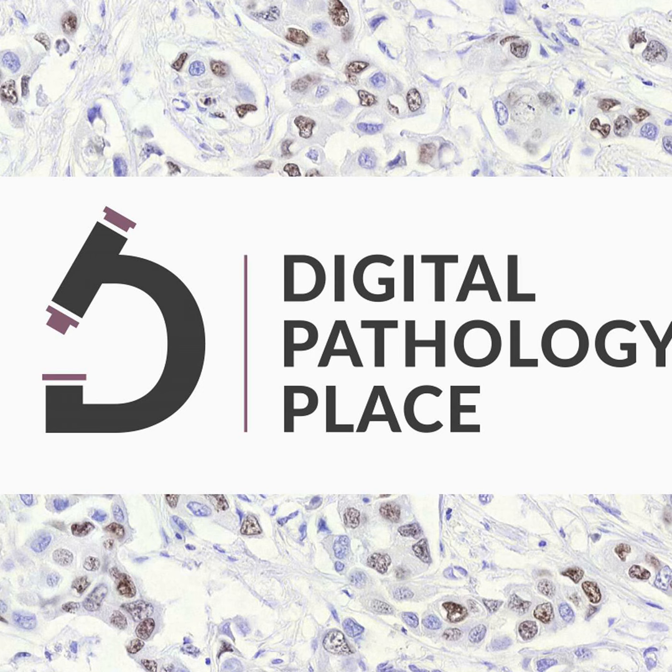So I think unless you get into something like virtual microscopy where you're dynamically judging how much information you have to take in different areas, the way these scanners work right now is that they make one digital image, and it can be zoomed up and down. And then, of course, depending on the lab use case, you need a certain bandwidth to manage that data. There's a so-called hot, warm, cold storage that might be useful for initial diagnosis versus archiving versus secondary consultations. I'm just saying those are the variables that people are thinking about now.